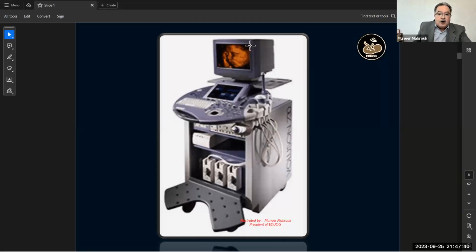So from the summation of the brightnesses here on the screen, I can read what's going on. This is leg, this is mouth, this is eye. Did you understand the idea, the concept of ultrasound? Was it clear, Dr. Shaiman? Yeah. Okay.